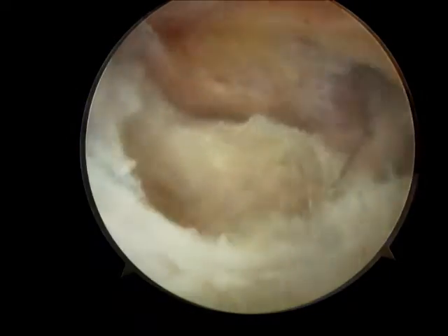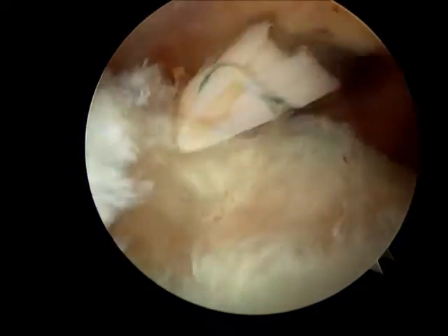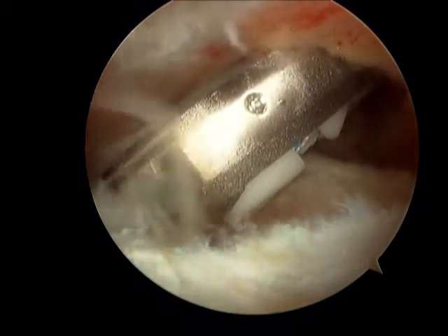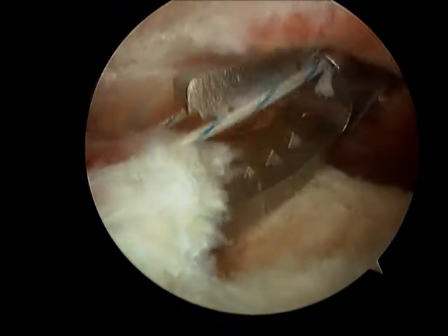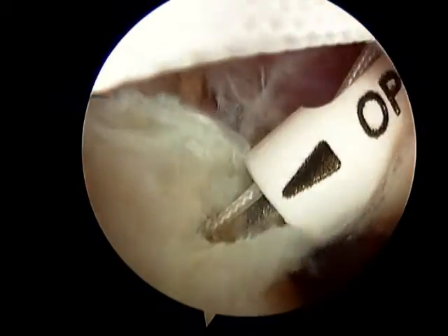Again we are using the 4mm shaver to suck out the calcific material. Often times there is a small hole once we have done that, and so we usually repair that — this time with an Opus Magnum system, passing the suture arthroscopically.